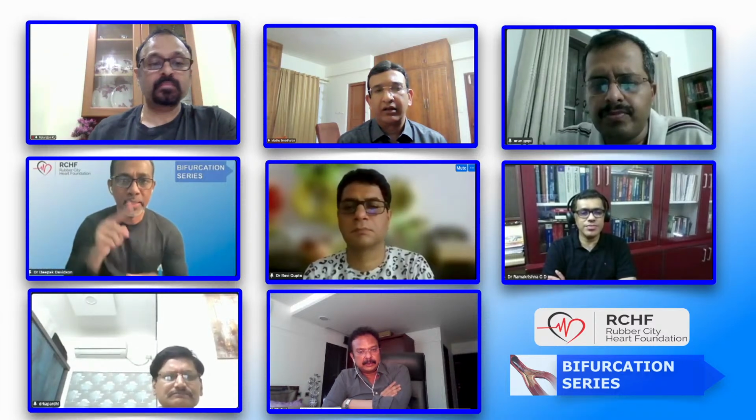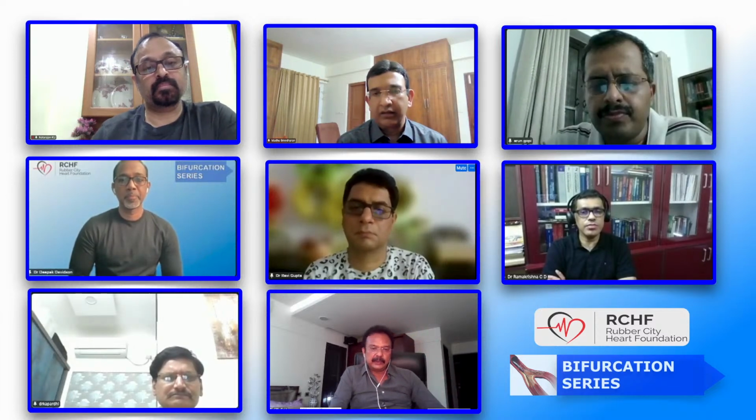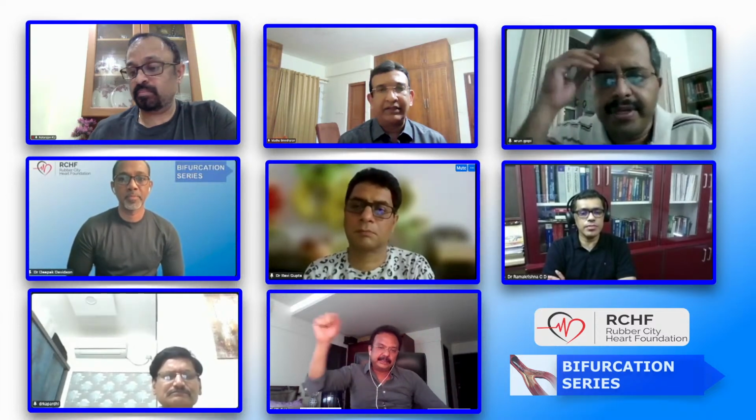How do you do that, Deepak? No, sir, the green dots. Initially, you have to calibrate it properly using the green dots. That's not normally done, isn't it? So how can you have the calibration wrong? You need to see all the 4 green dots, and at least 2 should be on the catheter. Many times we do not give a lot of attention to that particular step.